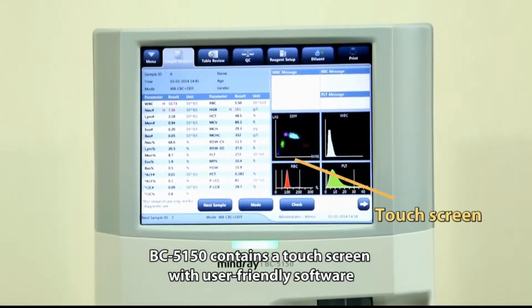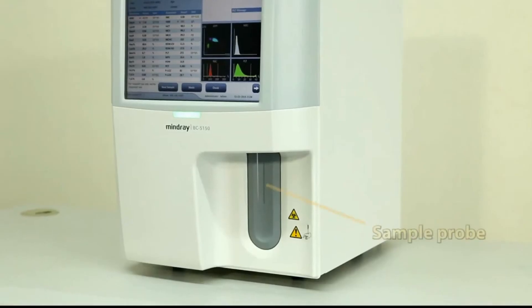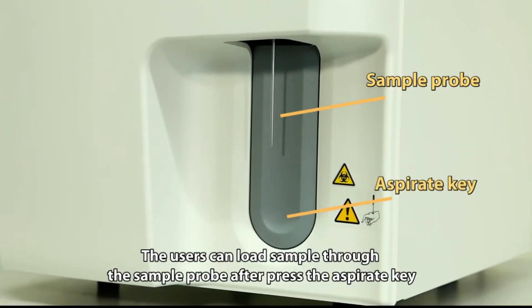BC5150 contains a touchscreen with user-friendly software, and the power status indicator shows the working status of the analyzer. Users can load a sample through the sample probe after pressing the aspirate key.